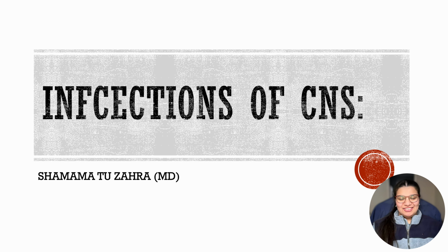Everyone, this is Dr. Shama Tazara, and today our topic of discussion will be very interesting and fascinating for pathologists to see under the microscope. This is infections of the central nervous system. It's always cool when we see organisms under the microscope, and I personally get very fascinated and enjoy that. Not good for patients, but we pathologists enjoy it. So, let's dive in. That's our topic today.